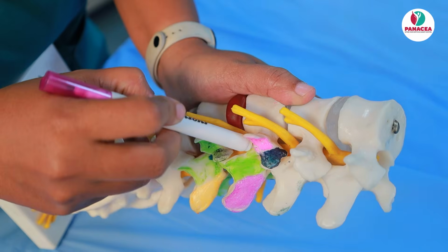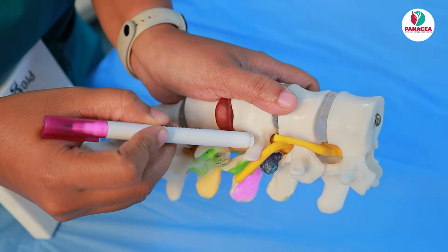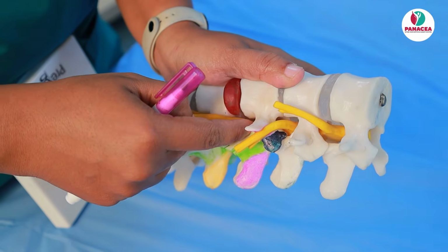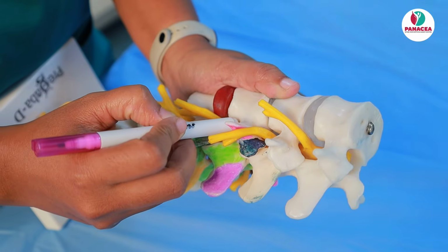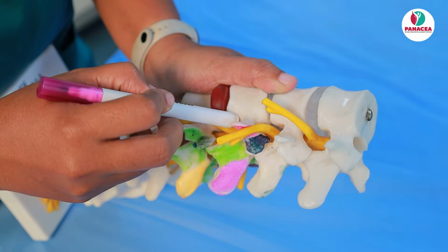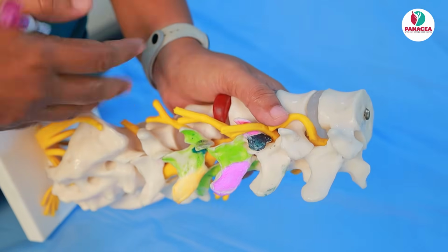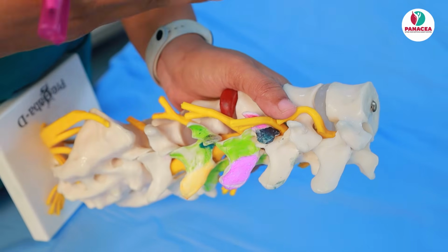This is the subpedicular approach: this is the pedicle, and we will be entering just below the pedicle. We don't want to hit the nerve. The nerve is located more medially, so we are going to go a little laterally and enter the epidural space, the ventral epidural space. So the drug will be exactly where the pathology is and we will get the maximum benefit. That is the advantage of the transforaminal approach itself.